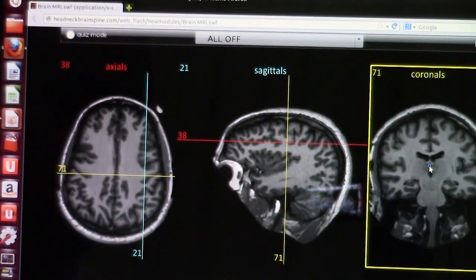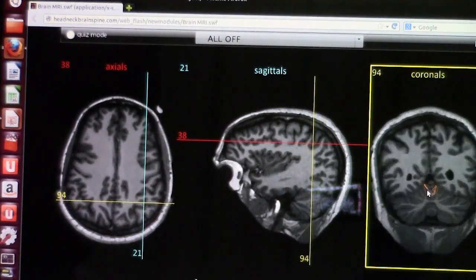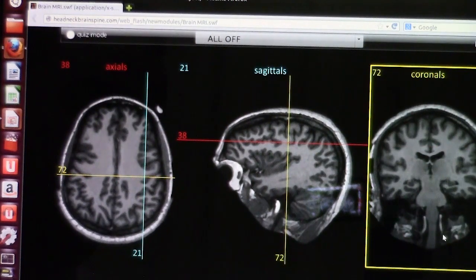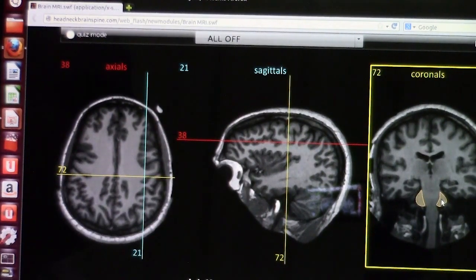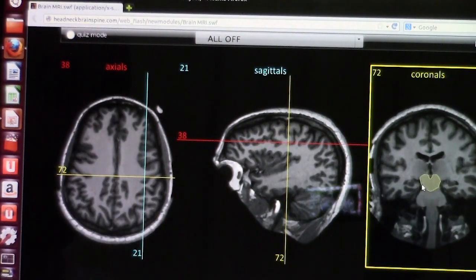Here you see the quadrigeminal cistern. You need to keep looking at the whole brain MRI. Here are the bilateral vertebral arteries and the medulla oblongata. Going up is the pons. The middle cerebellar peduncles are attached to the pons. The superior cerebellar peduncle connects the midbrain and the cerebellum, and the inferior cerebellar peduncle connects the medulla oblongata and the cerebellum.